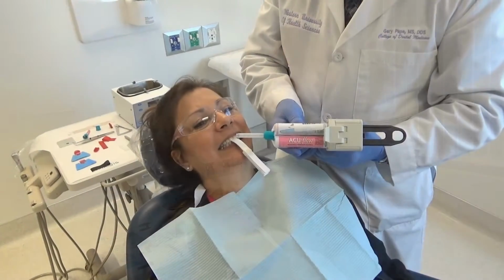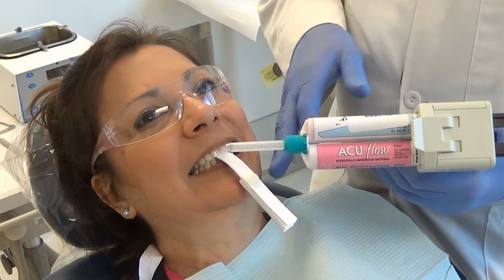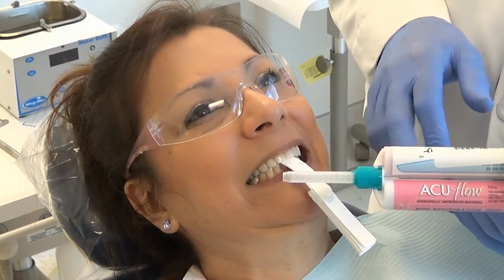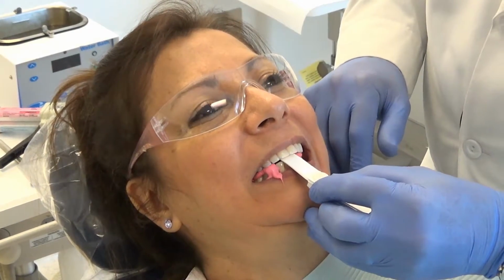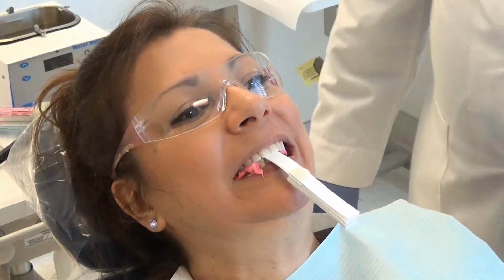So stay like that, and I'm going to take the AccuFlow and I'm going to squirt it on the back teeth on the lower, on both sides, and I'll squirt it all the way from the back tooth up towards about the cuspids, because the leaf gauge is right in where the centrals are. So go ahead and open, stay open, and I'm going to go ahead and squirt onto the back teeth up to the cuspids. And go ahead and close and bite on your back teeth. And they just hold that until it sets.